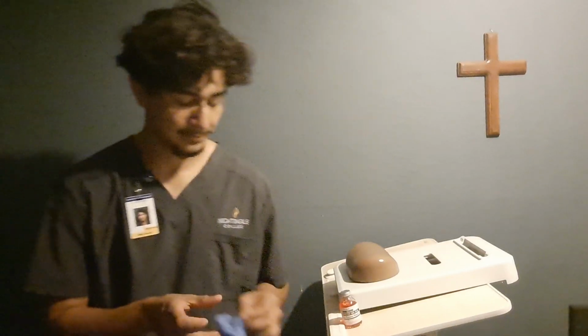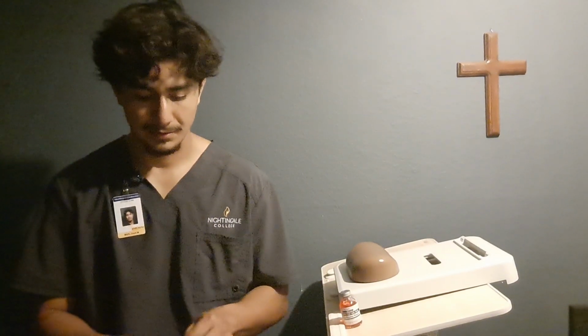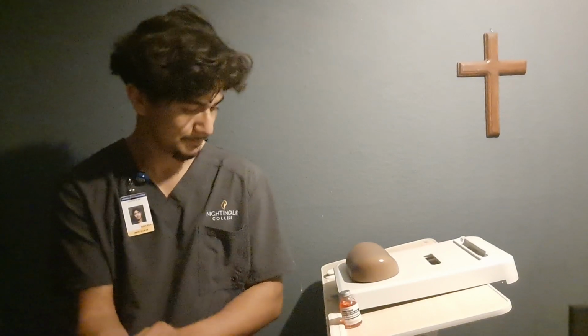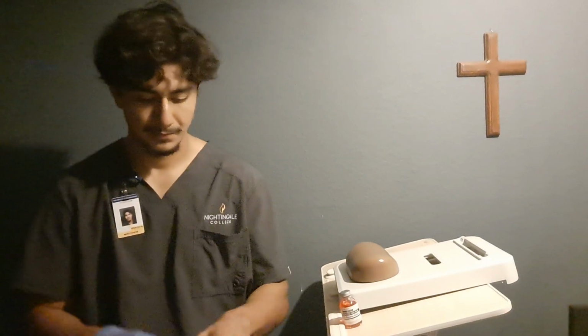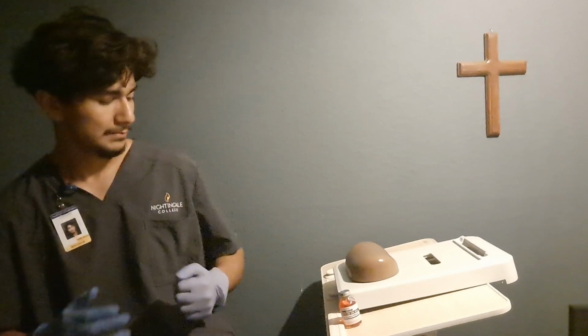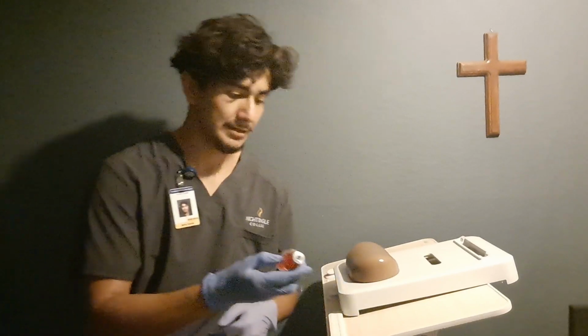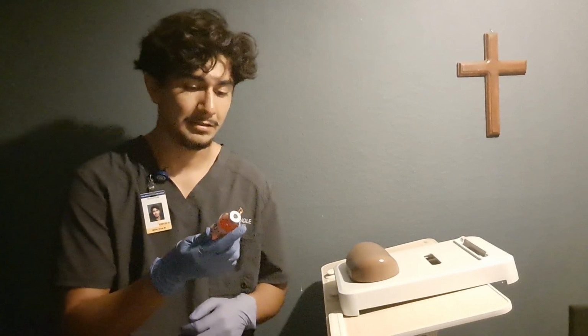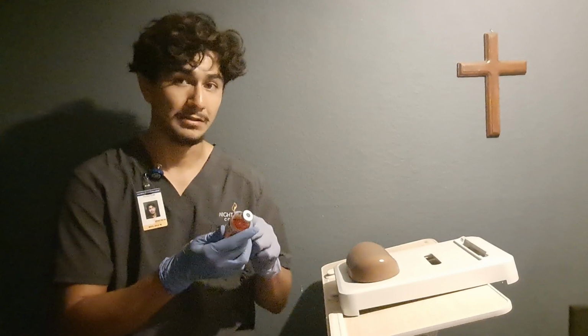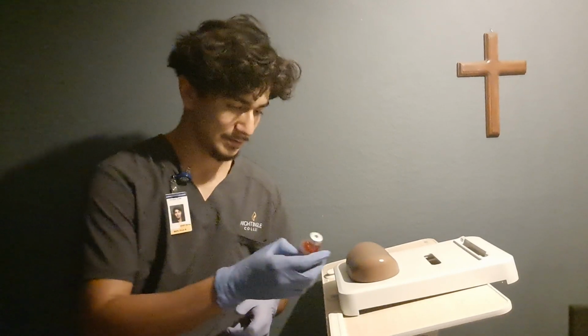Okay, Victor, so the first thing we're going to do is wash our hands, put on some clean gloves, and get our syringe. So once again, I'm going to go ahead and compare the medication to the medication on the order. Make sure it has the name of the patient. So this will be our third verification.